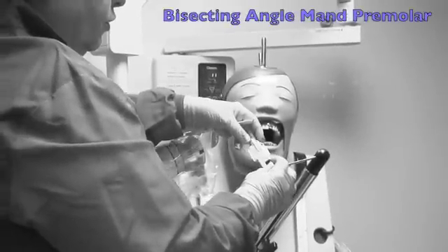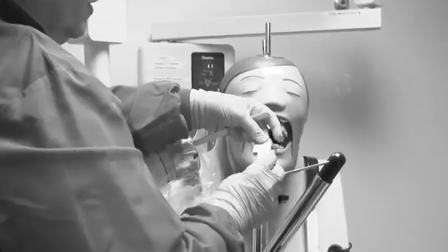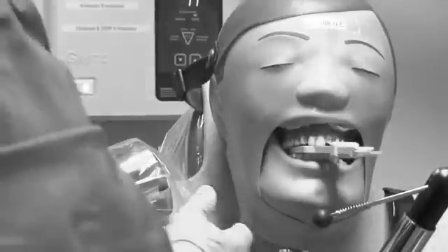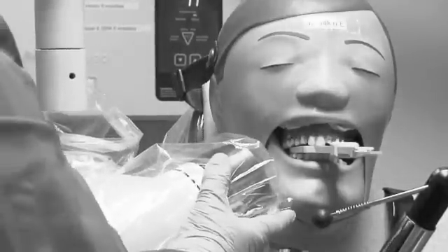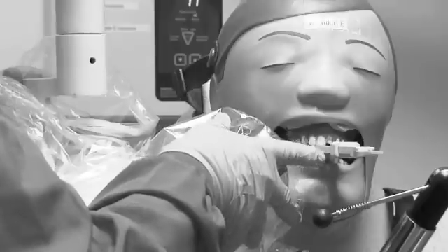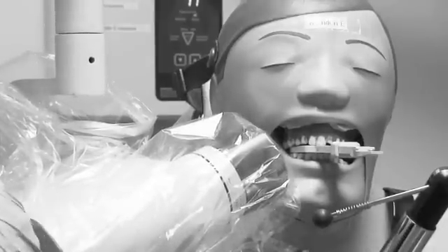Now we're going to the premolar view. We put our dot in the bite block towards the incisal edge and lock it in. We're going to go across the arch for the premolar view, towards the opposite lateral canine. As we close, bring your hand towards the PID and then line up in between the first and second premolar. Check the front of the film with the holder, then the border of the mandible, and you will not cone cut.